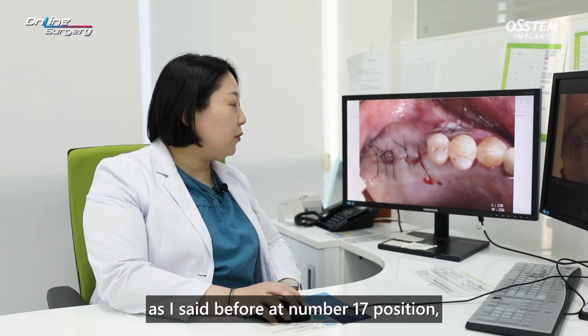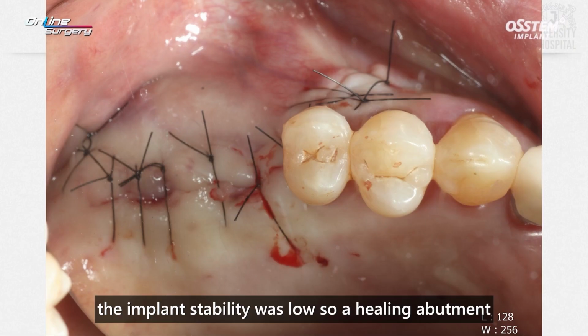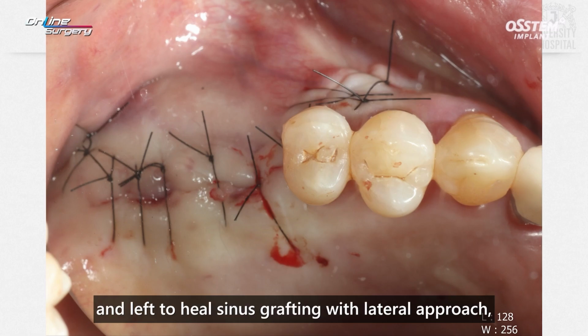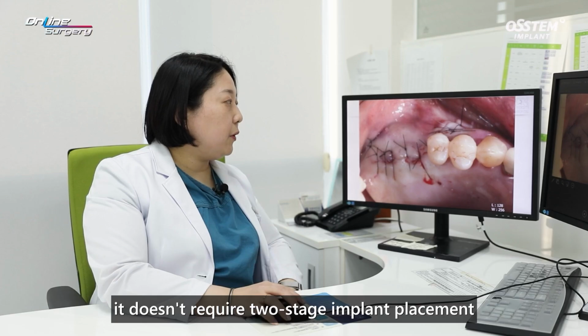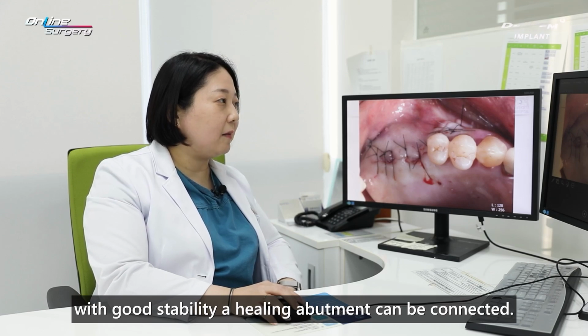surgery. As I said before, at number 17 position, the implant stability was low, so a healing abutment was not connected. The implant was submerged and left to heal. Sinus grafting with lateral approach doesn't require two-stage implant placement. With good stability, a healing abutment can be connected.